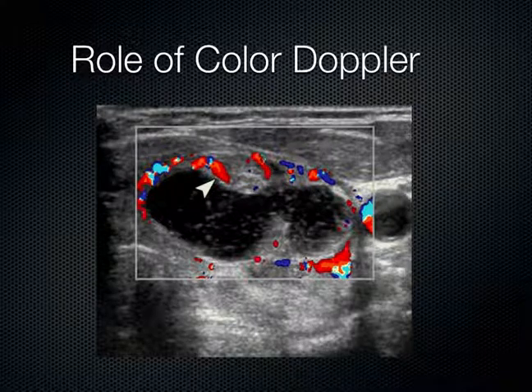Sometimes you see a component within this nodule and you think, is it debris or is it actual tissue? Debris wouldn't light up with color — so we know that this is actual tissue here. Ultrasound-guided fine needle aspiration was done, taking a needle into this nodule and into this region, and the lesion was benign at cytologic examination.